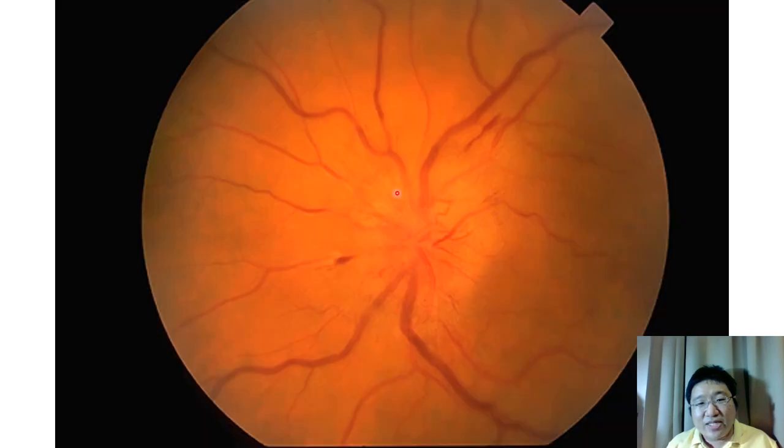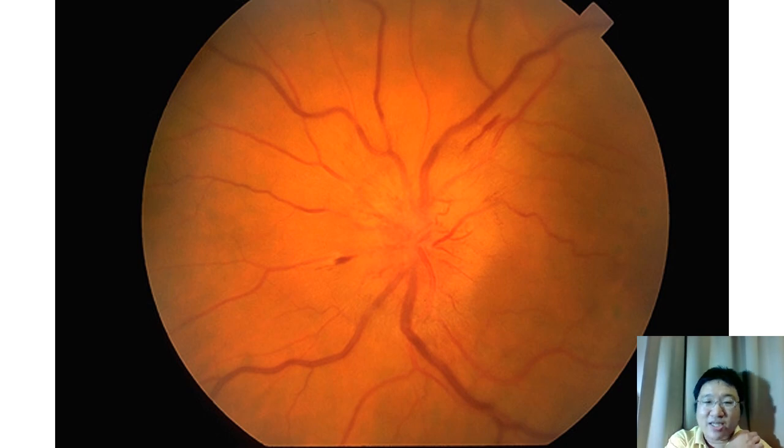And here we see that the optic disc is swollen, with engorgement of blood vessels. This is papilledema. It is very important that you can make the diagnosis of papilledema, because the patients may have something bad inside of their head. This is a sign of increased intracranial pressure.